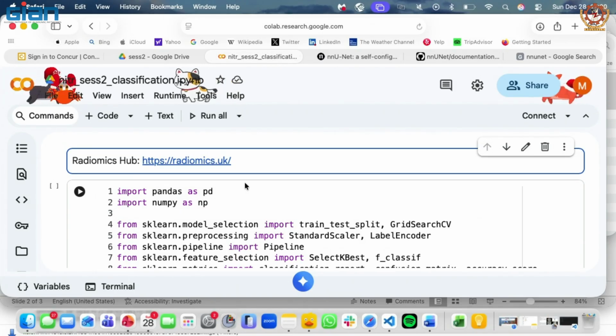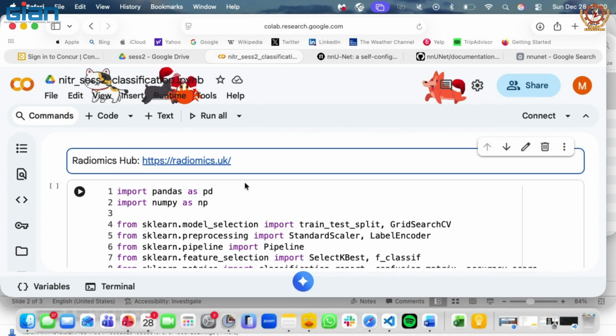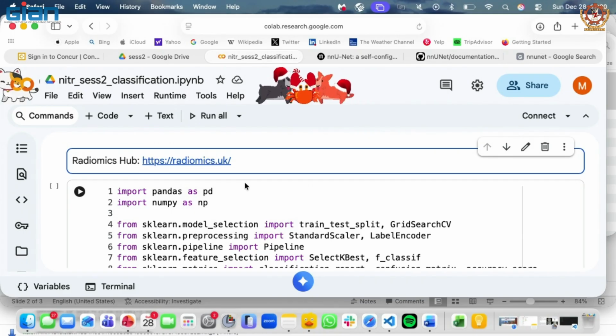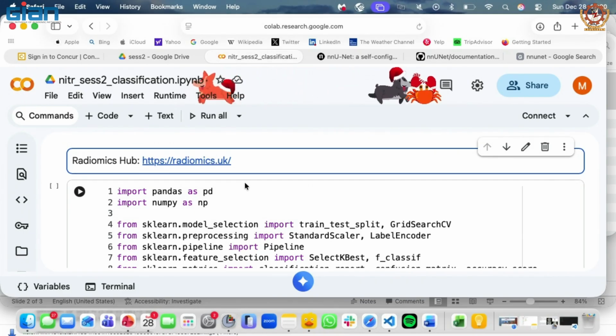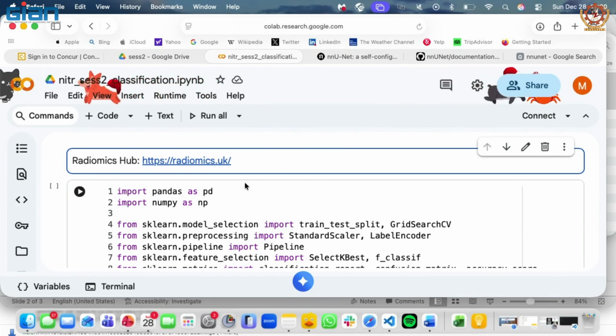Pathology data sets I can't help with, but if you're working with radiology, I have a good solution for you. These datasets are huge, they will be in GBs, processing them will need time, and you will get multiple errors, and at some point you will just dump it.